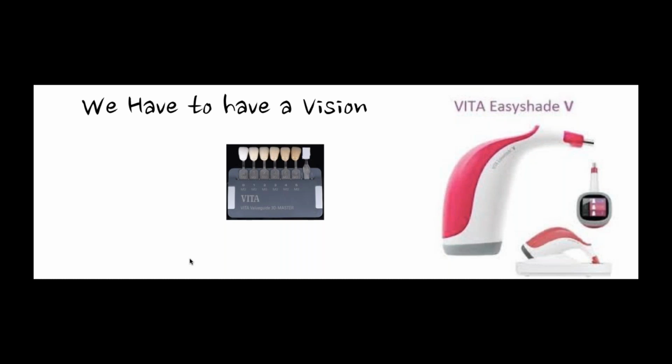The EasyShade is really nothing more than a densitometer. It's measuring color, a photospectrometer, where it's actually measuring color in depth. So it gives me a rough idea of what the base color is in my system. And what I find is, if that coincides with what I just picked, I feel kind of comfortable and happy. If it doesn't, then I start to worry that maybe I didn't see things the right way.